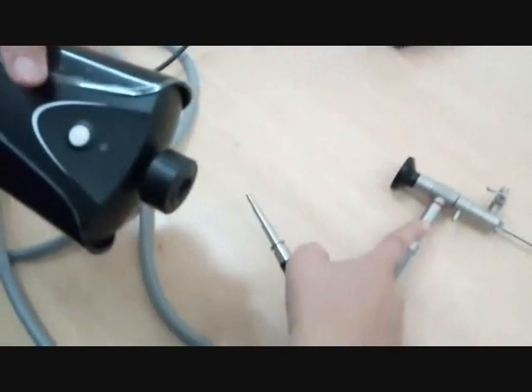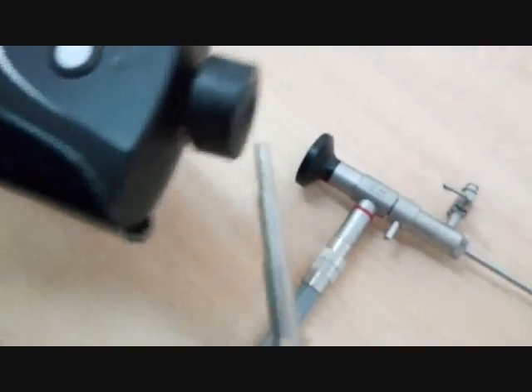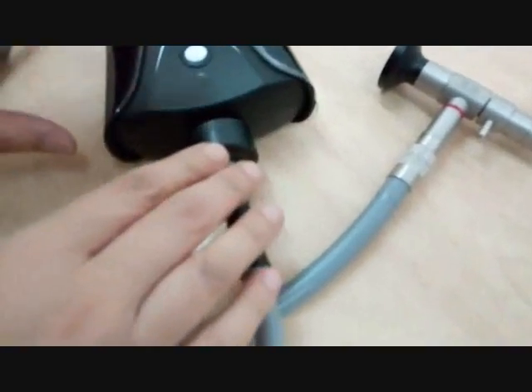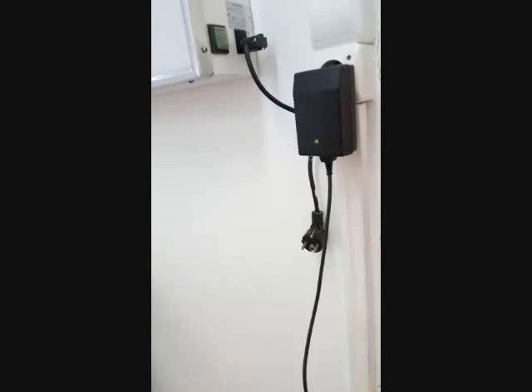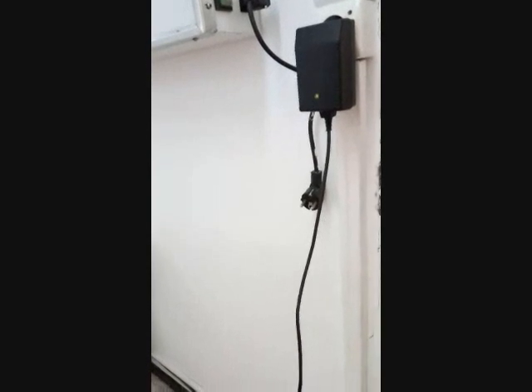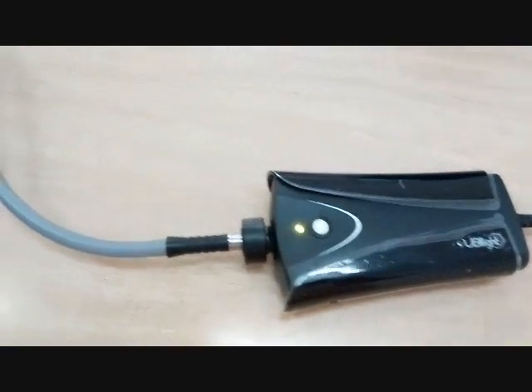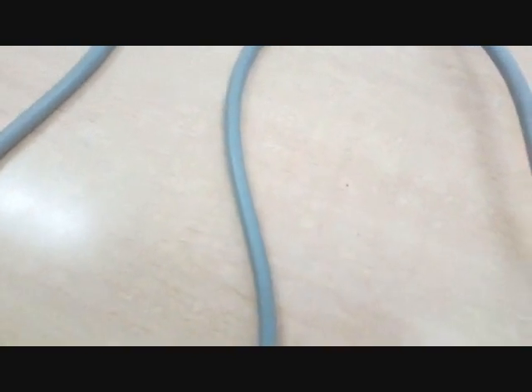So we connected the first end of the light cable to the scope. The second end of the cable we inserted inside the light source like that. All that is left is to press the button there to turn on the light. But before, we should plug it. See, the plug in the wall, it'll feed the light source, which we see here, for example, on the desk. Here's the light source. And the cable will conduct the light to the scope to which it is connected.